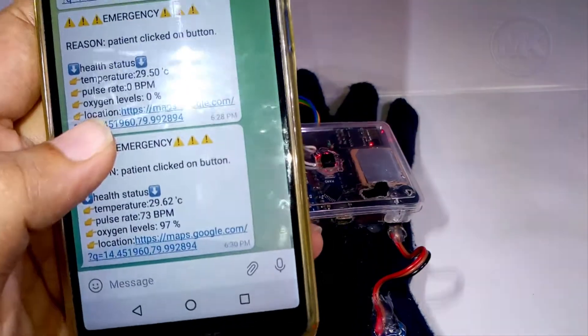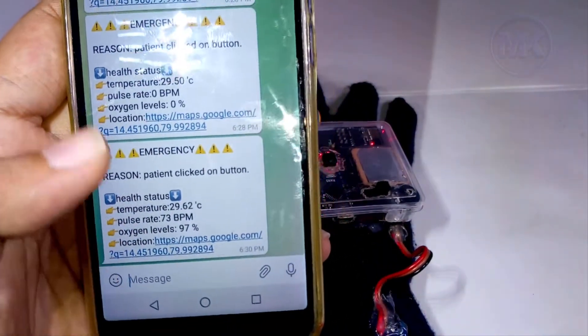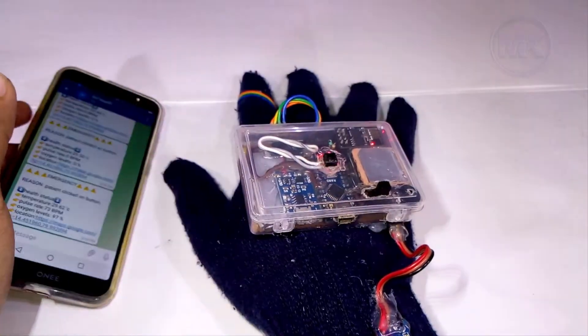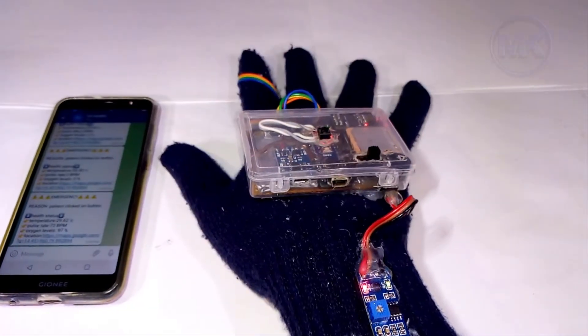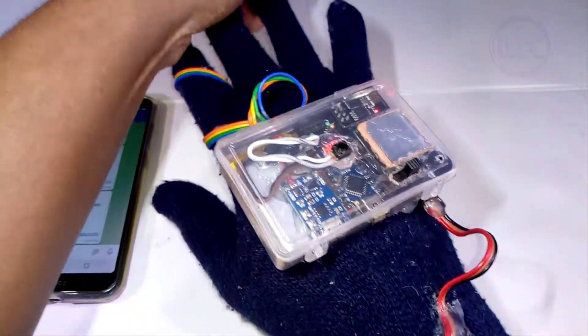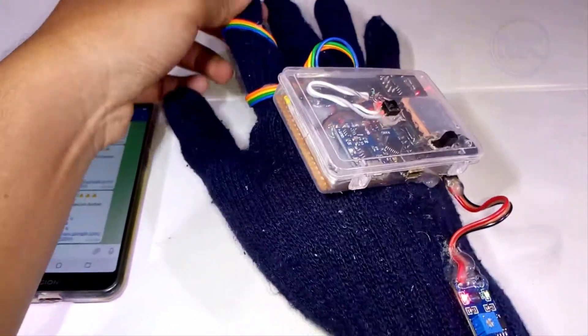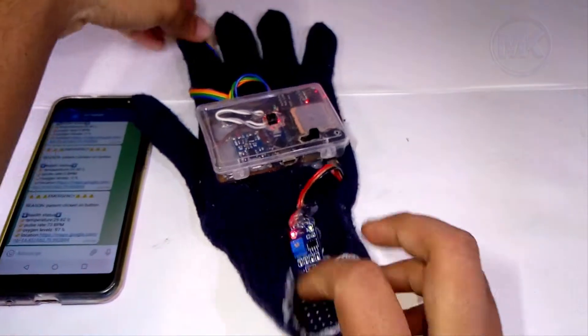In another case, a message will also be received whenever the patient's health conditions are abnormal — that means health values have exceeded the maximum or minimum limits. In that case also, a message will be received in Telegram.